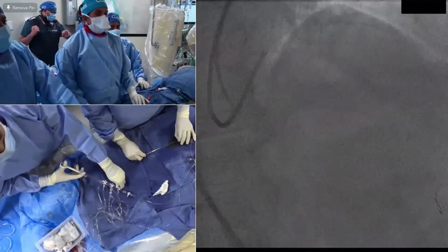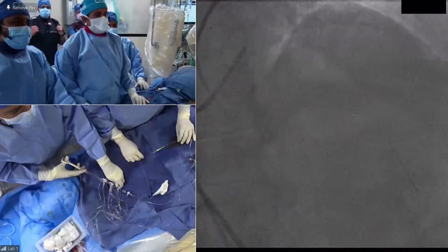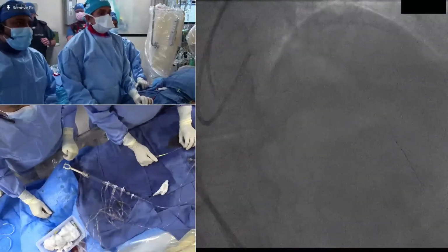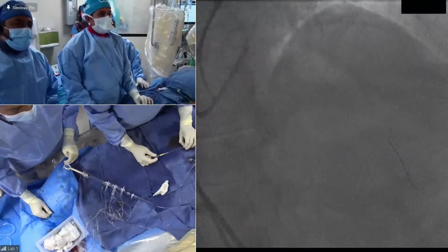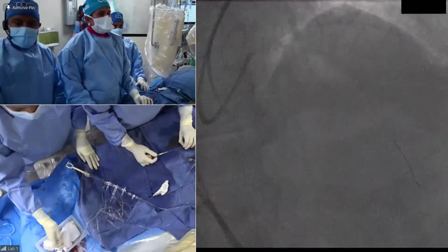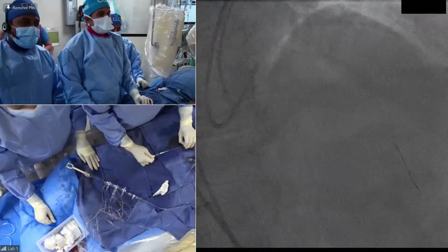So you show a CTO because they can. Yeah. What wire is that? You want to Rota? Yeah. That's a regular Fielder. I think the backup here is extremely important. Guiding catheter next to us there. I think we do Rota. Yeah. Rota or orbital? Rota.